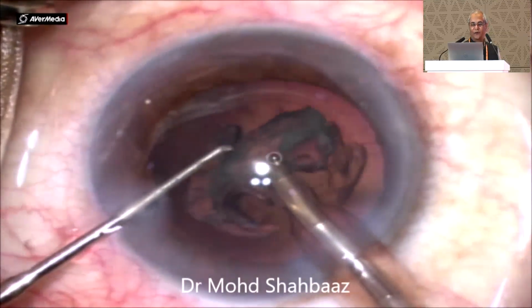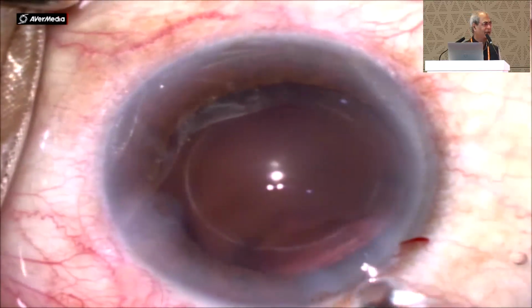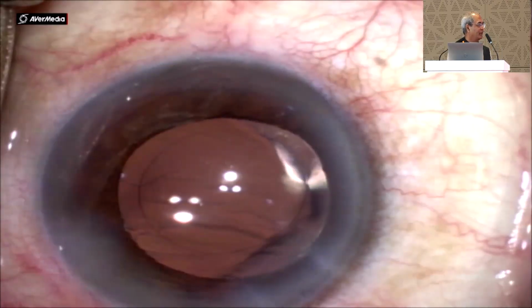So there is no cortical matter remaining. Everything is done in one go. You can just implant the IOL. Rhexis size is again important. If you want it to be fully covered from all the sides, it has to be 4.5 to 5.5. Thank you.